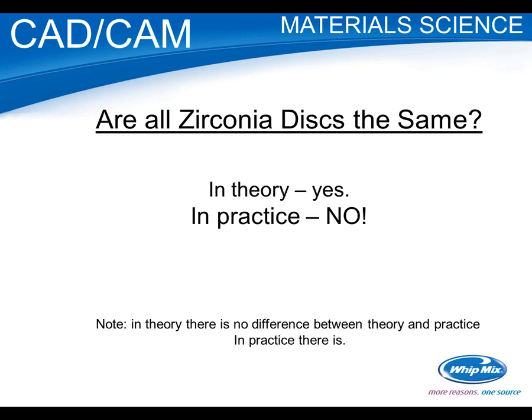So in theory, you should be able to use any disc, but in reality, there are a lot of things that go into making that disc. I just want to make you aware of some of the issues. When I was at that ADA meeting, they called it Joe Banana: somebody who's just bought the equipment and qualified using the ceramic standard could be making zirconia, and it may not be what you need.